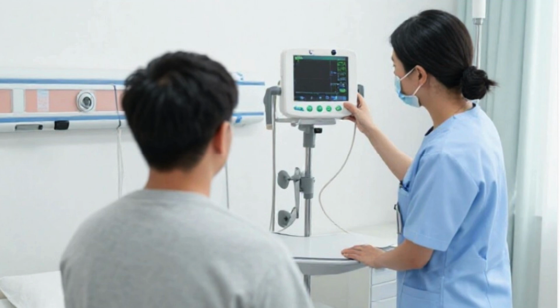Modern patient monitors often include network connectivity. This allows patient data to be transmitted to electronic medical record systems or central monitoring stations. From a technical perspective, electromedical technicians must ensure that network connections are stable, secure, and compliant with hospital standards.